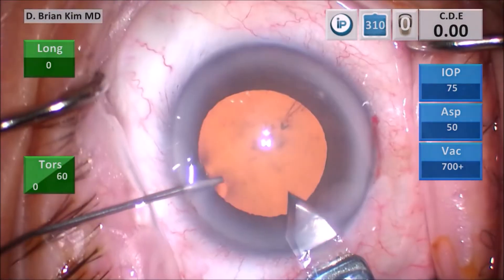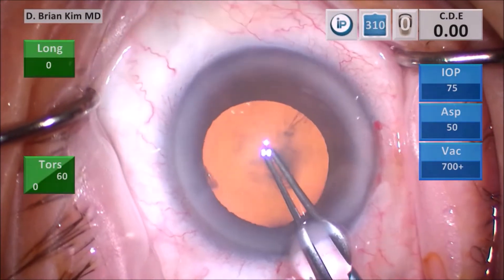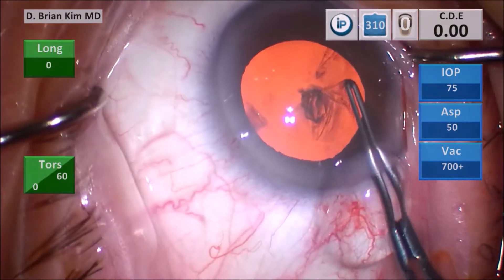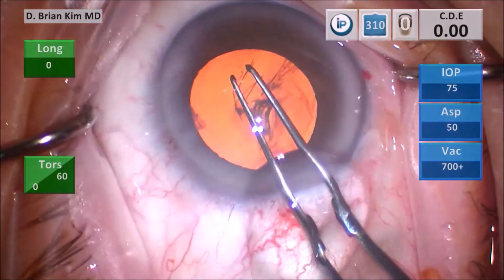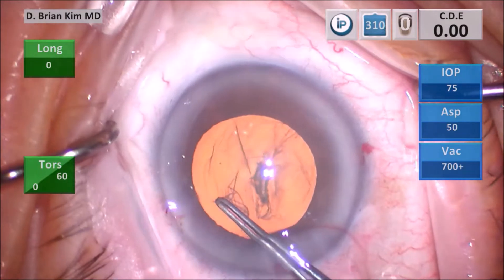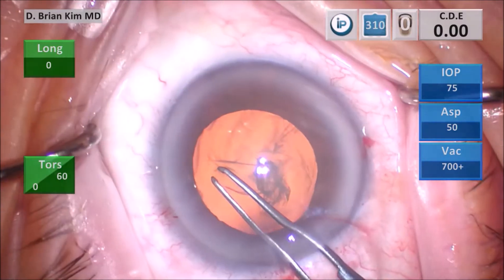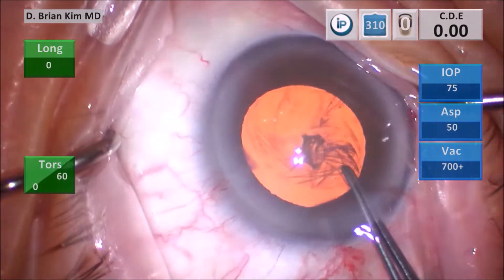I then do my puncture style capsulorrhexis. I make a puncture, pull down and sweep a little bit to the right to create a small flap. I grab and re-grab, trying to follow the contours of my corneal mark, which helps me center and size my rhexis. I grab the flap edge and go around a few clock hours then re-grab, making sure I don't put any pressure on my wound to minimize viscoelastic egress, which keeps my capsulorrhexis centered without radializing.